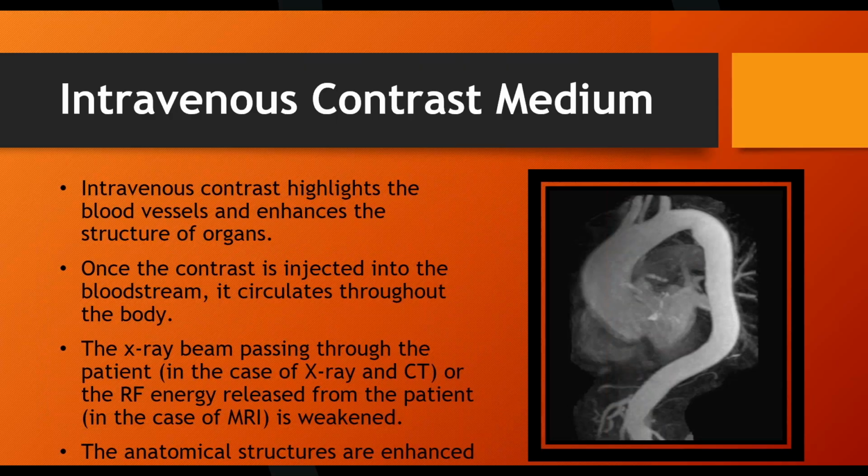They've been trained. But if I'm going to take an image of this blood vessel right here, I can't just inject the fluid, because the patient's alive. The patient's heart is beating. So as soon as you inject the fluid here, it's literally going to be here for about 1 second. Heart beats, it moves. Heart beats again, it moves. So it's constantly a moving target. That's something the operators do have to take into consideration and compensate for when they're doing these X-ray images. We can't just inject this contrast and then set it up and shoot it.